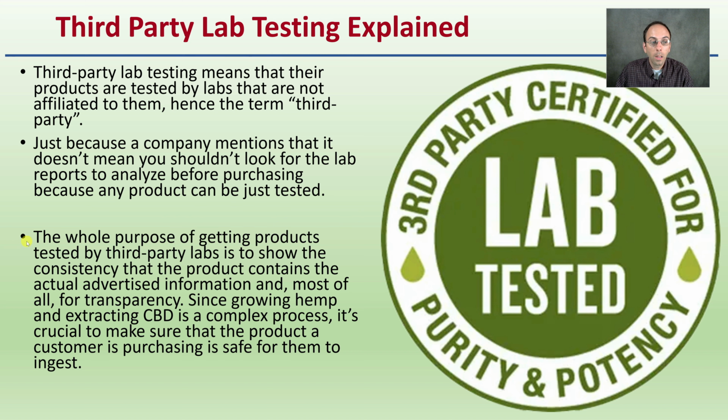The whole purpose of getting these products tested by third-party labs is to show that the consistency of the product contains the actual advertised information. And also, most of all, the transparency is important. Since growing hemp and extracting CBD is a complex process, it's critical to make sure that the product a consumer is purchasing is safe for them to ingest. And that's only possible with the confirmatory results of a third-party test.